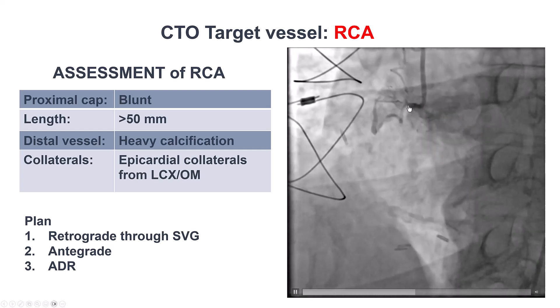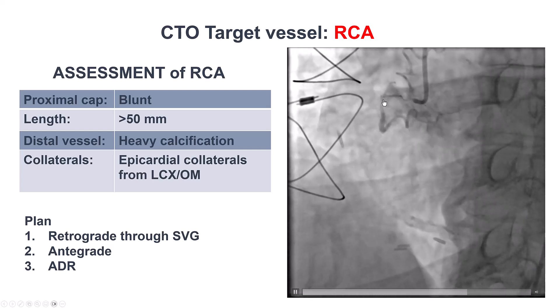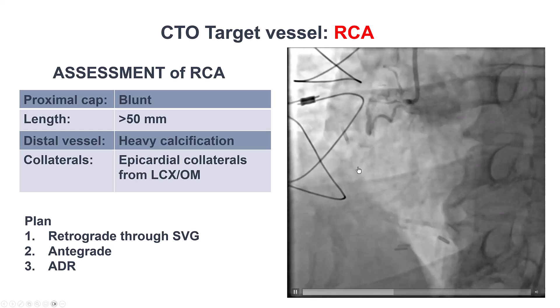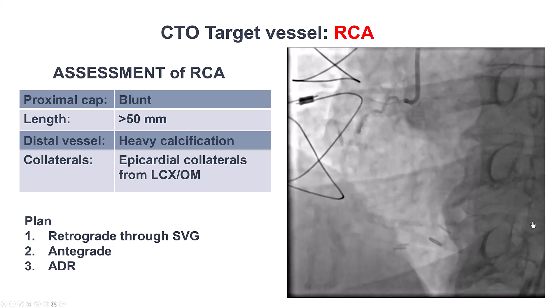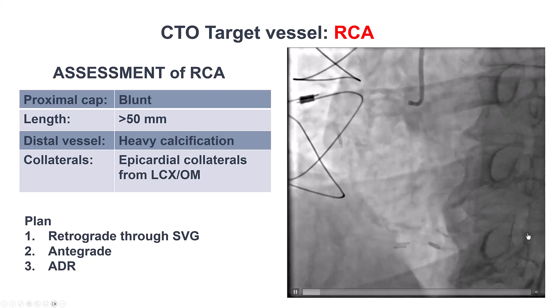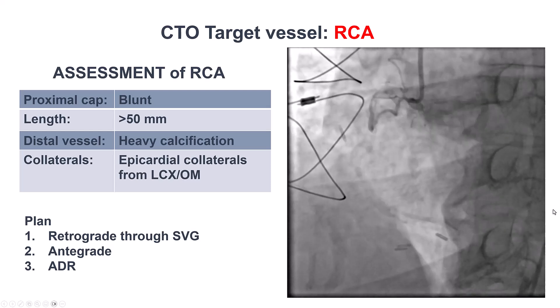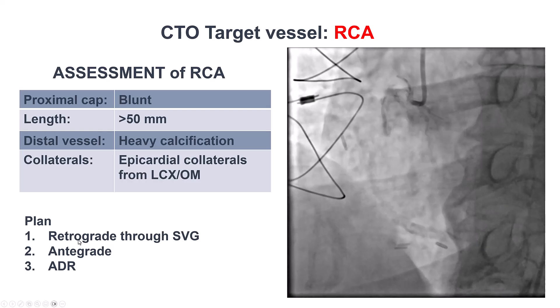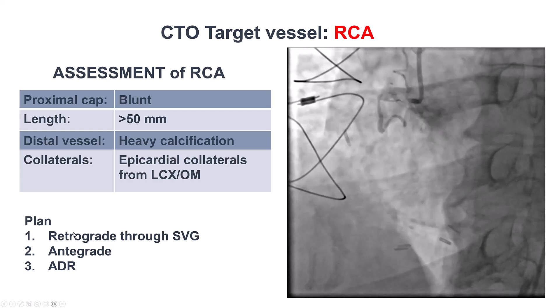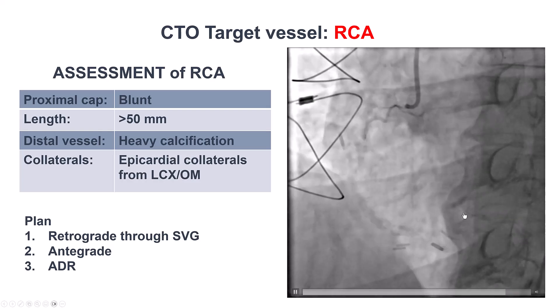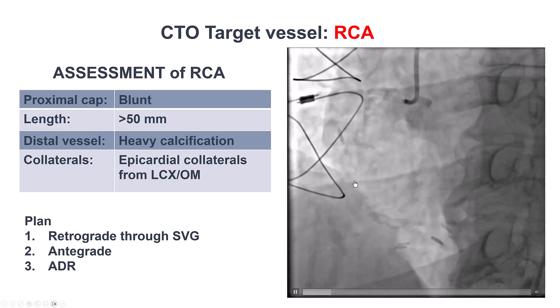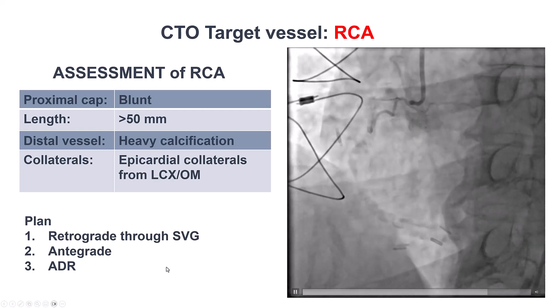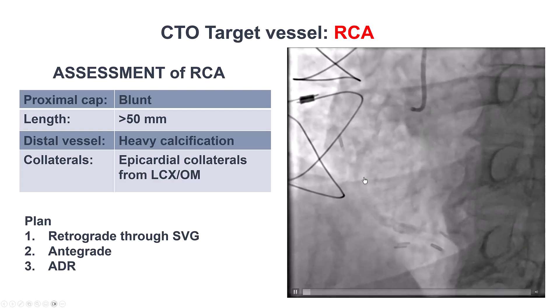This is a very challenging CTO. We have a blunt proximal cap, a long occlusion length with heavy calcification, and the right posterolateral was filling through epicardial collaterals. Our plan was to first try retrograde through the vein graft to the PDA, then try antegrade with antegrade dissection re-entry given the long occlusion length.